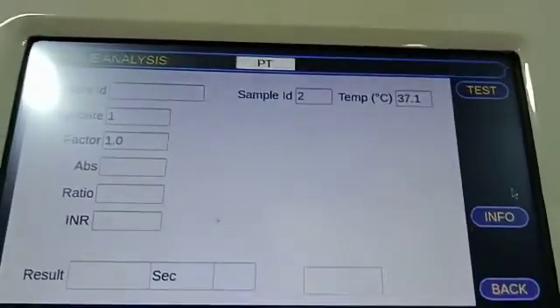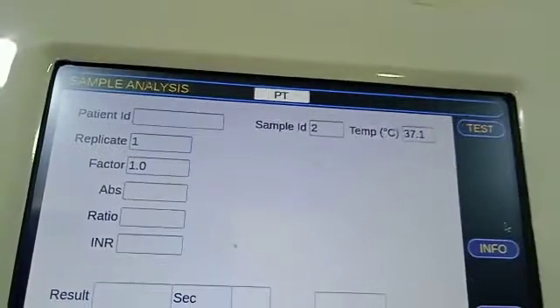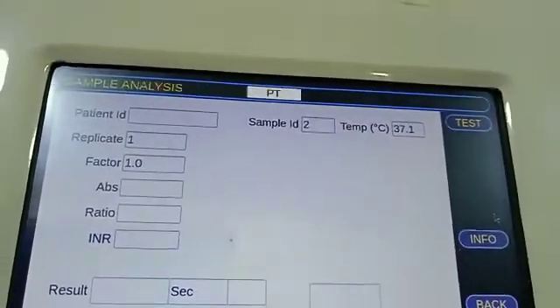Then incubate for roughly around 3 minutes. After the incubation of 3 minutes, we will proceed with adding the reagent.